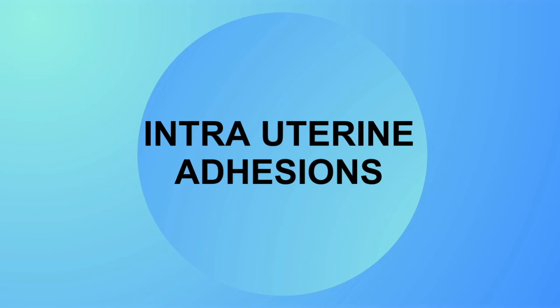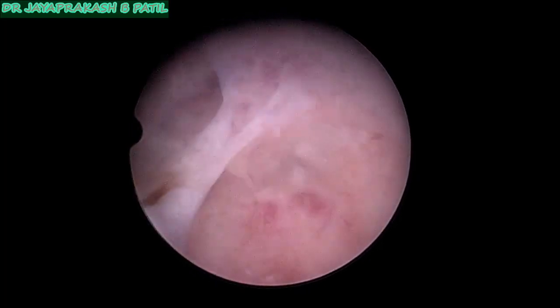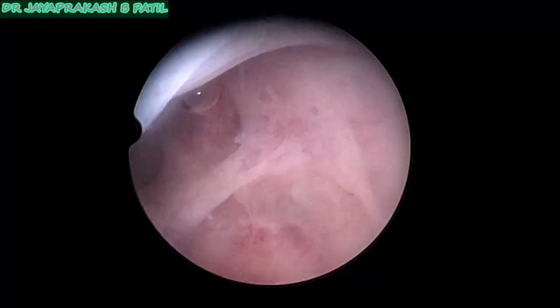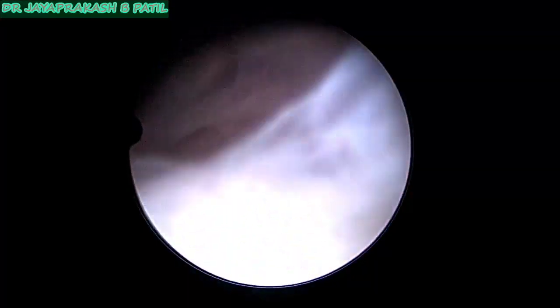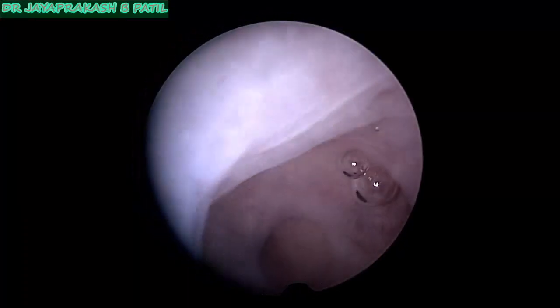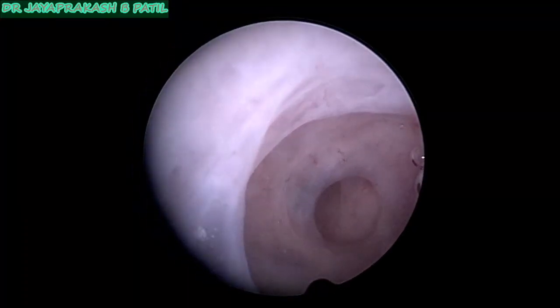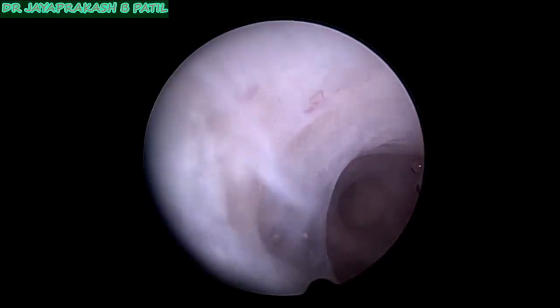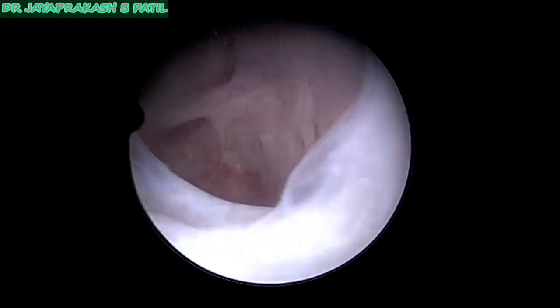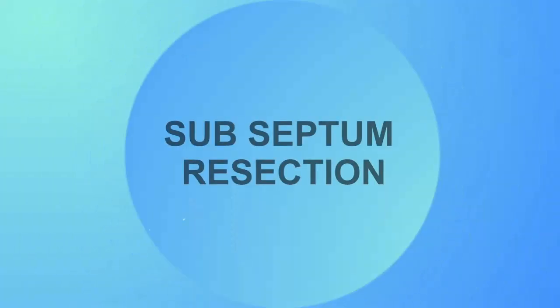Intrauterine adhesions, which are very typical of endometritis or sometimes Koch's infection, can be evaluated on an OPD basis. The video you are seeing is basically of tuberculosis.